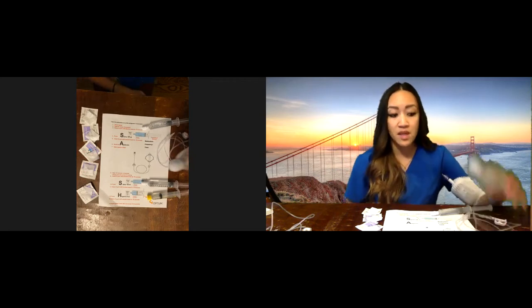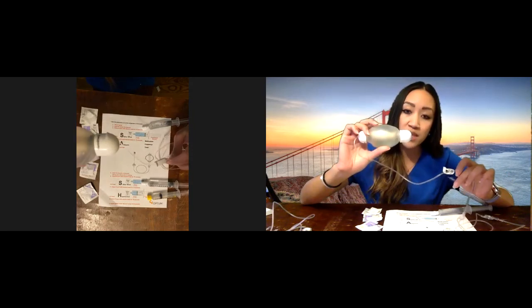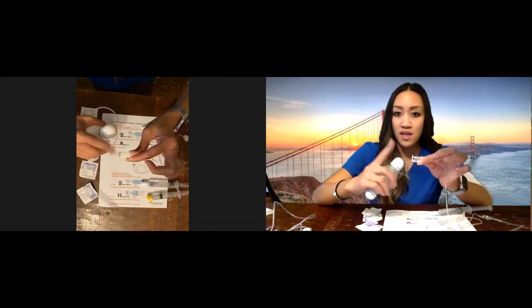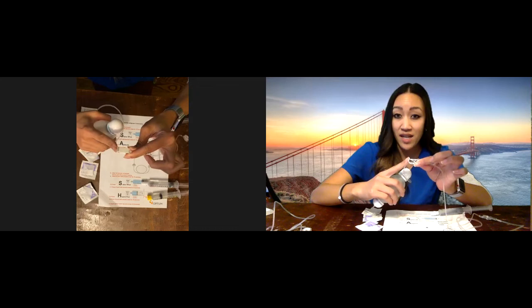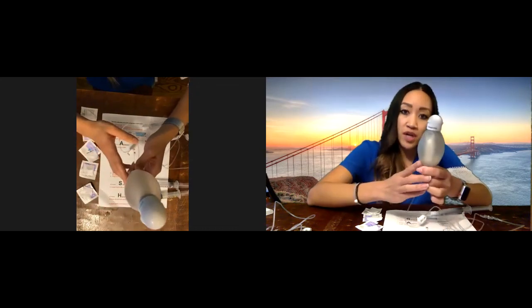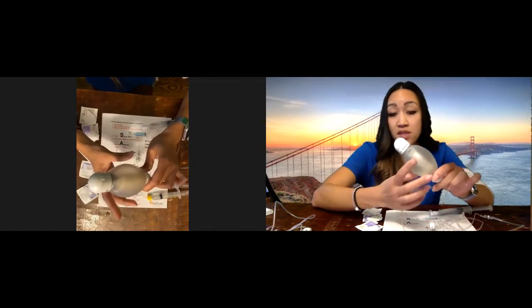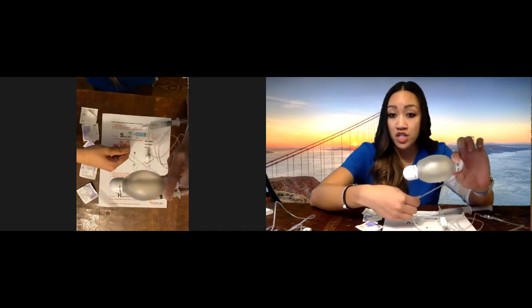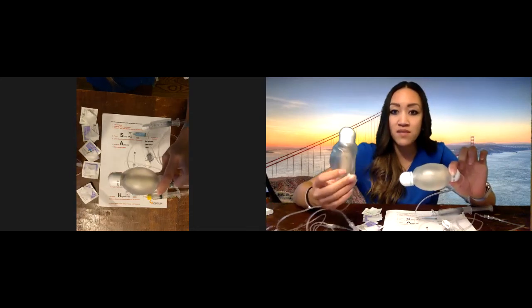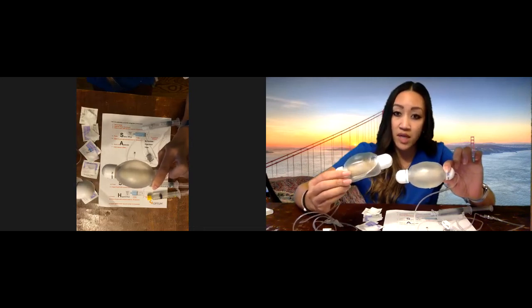So first off, let's go over the pump. The elastomeric pump is a pressurized ball where it will be given at a certain rate once you hook this up to your IV and you open up the clamp. The clamp is essentially activating the medication to self-infuse. The ball is pretty firm when you first receive it and that's how you know it's full. Everything comes primed and ready to go when you get your shipment. This is what it looks like when it's empty — the empty ball is deflated and it looks like a raisin.